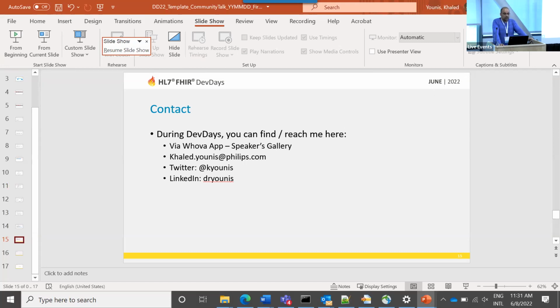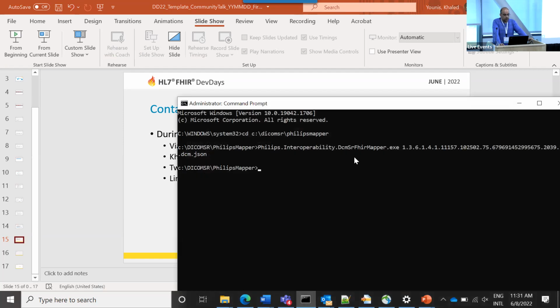So we have developed an implementation resource that uses a Scriban template for actually doing the mapping. For that, we identify the mapping specification in this directory that includes the mapper that was developed by our colleagues.